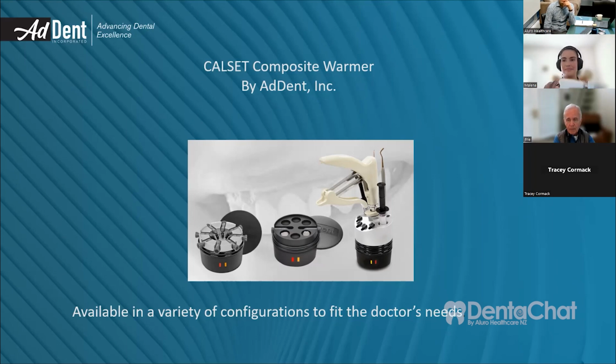Good. And what about a syringe or a compule to fit in the slots? A syringe to fit, I'm not sure. We have a 7-hole syringe. The multi-tray has 2 slots which hold some of the syringes. The 7-hole syringe tray holds more different sizes, and there's no standardization in dentistry. This is part of the problem.